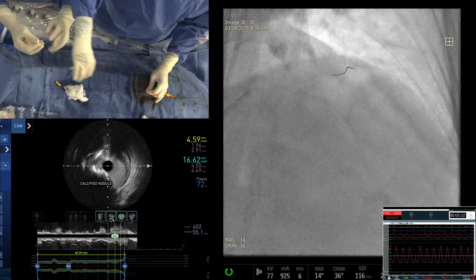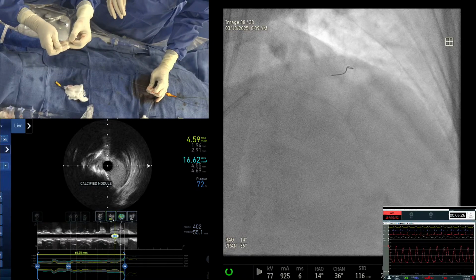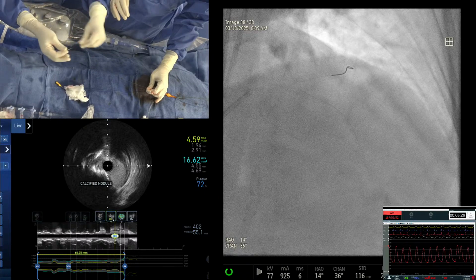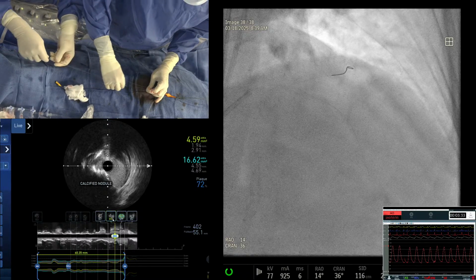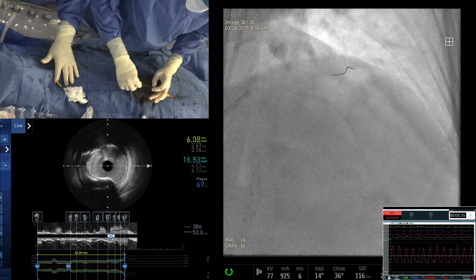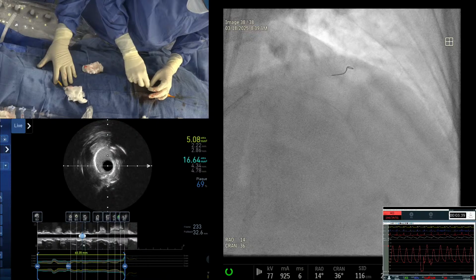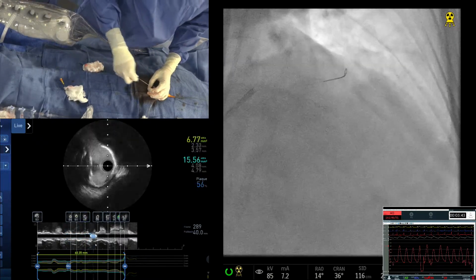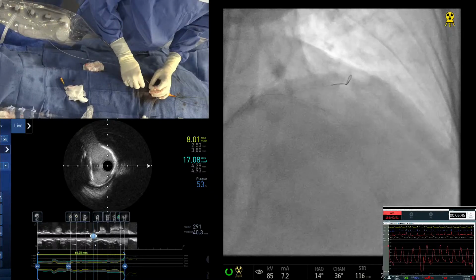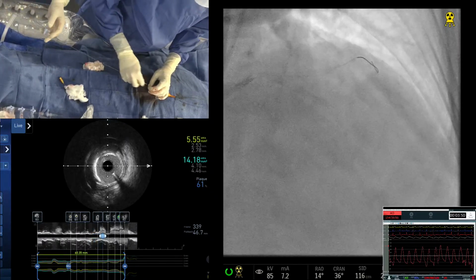So we are going with the Trio 20 millimeter non-compliant balloon. Make a little room. So the key is that a balloon in pre or post IVL does not alter or neutralize the efficacy of your IVL. That's one point we want to make. Even post IVL, some people will go direct with the stenting. In a calcific lesion like this, even after IVL, I would still go with the high pressure balloon, open the lumen before you stent it.